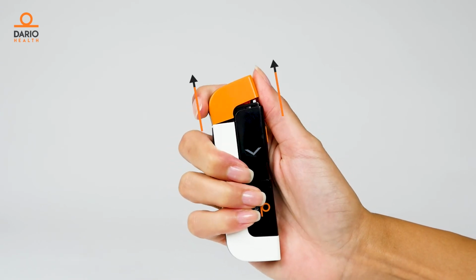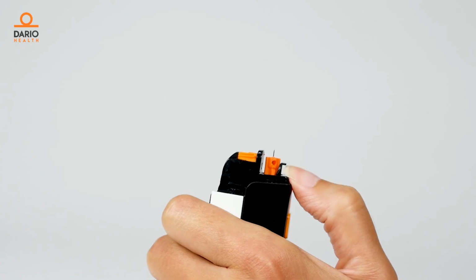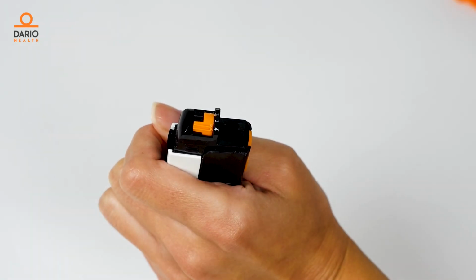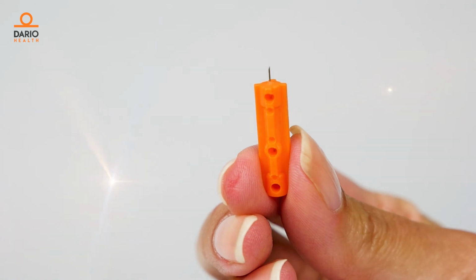Remove the lancet cover and then push up gently with your thumb on the side of the lancet where you see the little tab here. If you push it up past this wall, you can safely remove the lancet. Make sure you dispose of the lancet in accordance with the biohazard laws in your county.